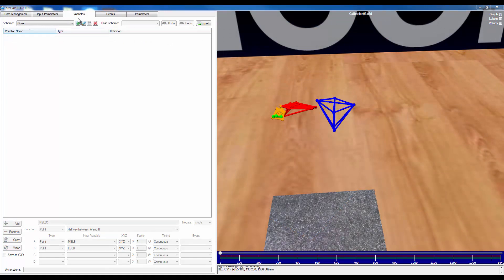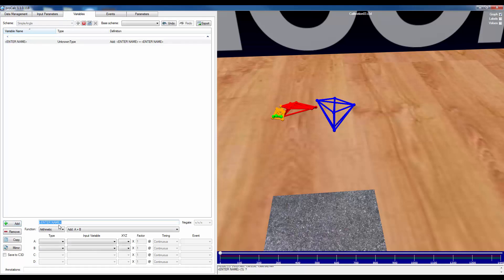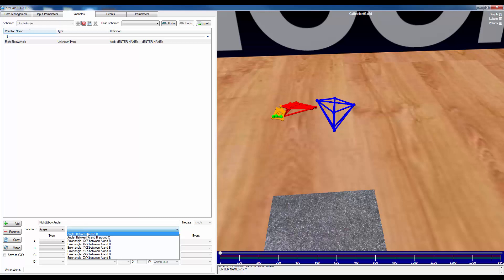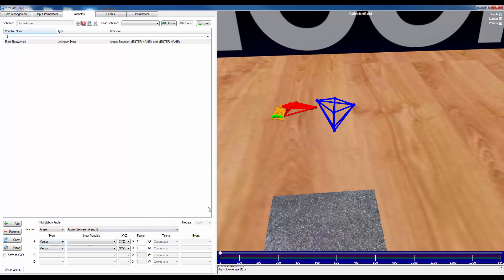To create a simple angle, I'm going to navigate back to the variables tab and create a new scheme called 'simple angle'. I'll add a calculation for 'right elbow angle', change the function to angle, and select the angle between A and B. Since this requires vectors and we don't have any calculated yet, I'm going to first create vectors — from the elbow joint center to the shoulder joint center for the upper arm, and from the wrist joint center to the elbow joint center for the lower arm.